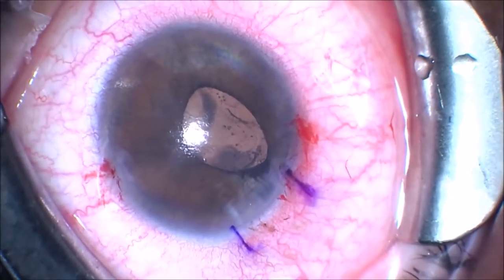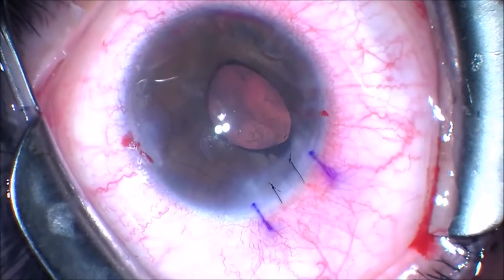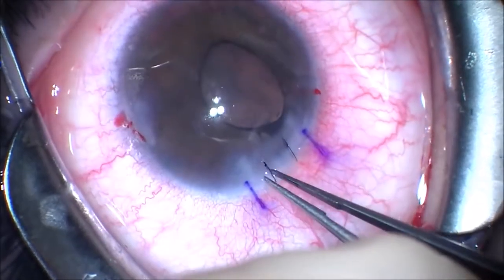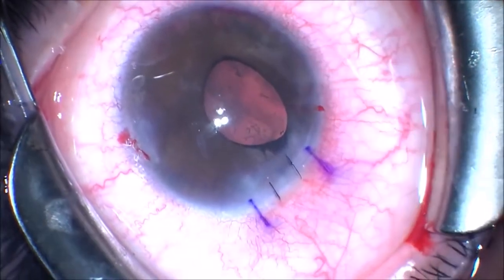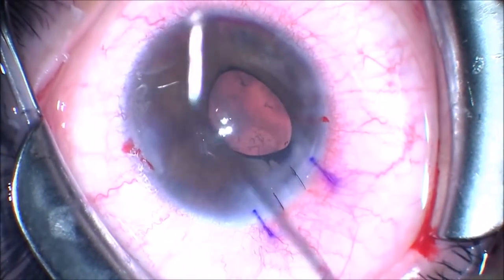You can see underneath the iris implant the patient has some degree of cortical cataract starting. There's also ectropion uvea in the clinic. On gonioscopy, which is examination of the angle, we noted they had extensive amounts of peripheral anterior synechiae, but with some areas of open angle.